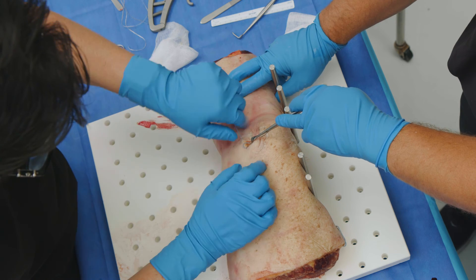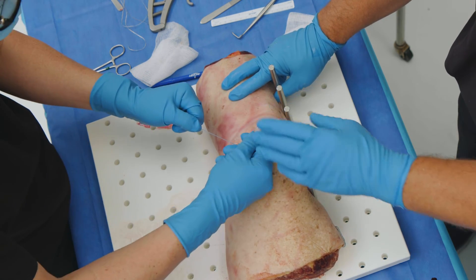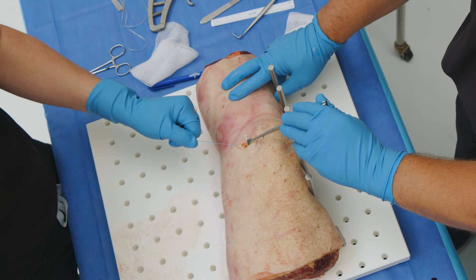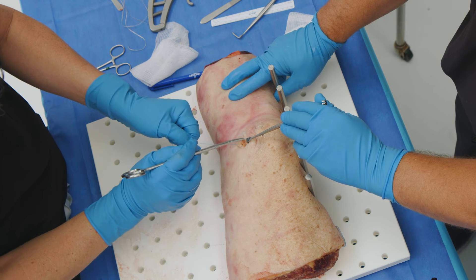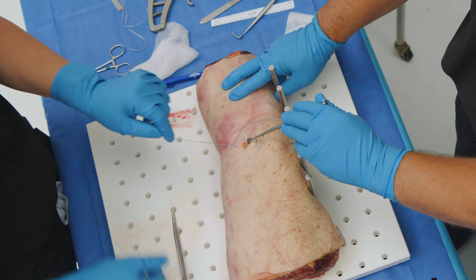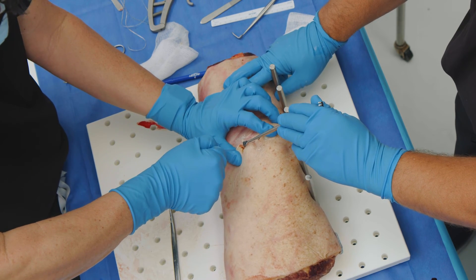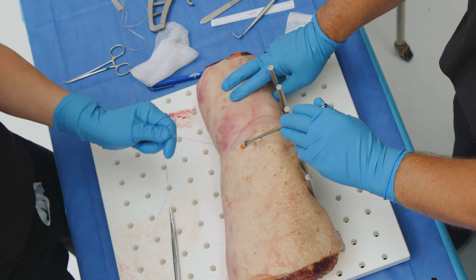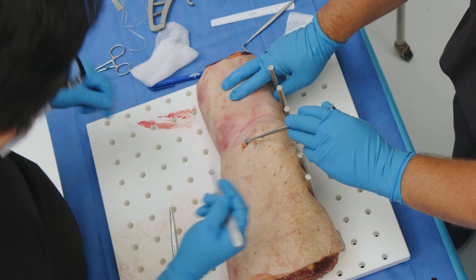Now all we have to do is pull on this suture, and you can see in the hole that the repair suture is now through the MPFL — very easy. Now if I pull, it sets the MPFL into position. It's now holding nicely. At this point we simply cut off the repair suture, close the wound, and we're finished.